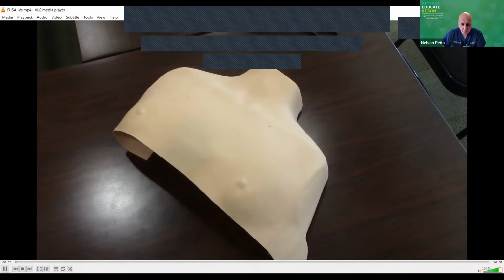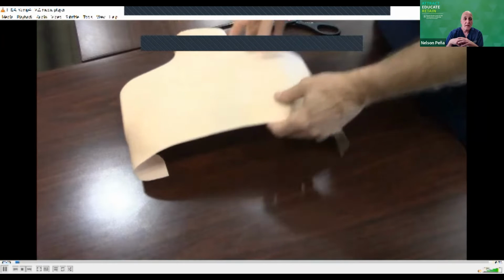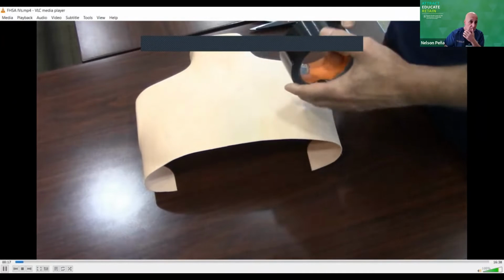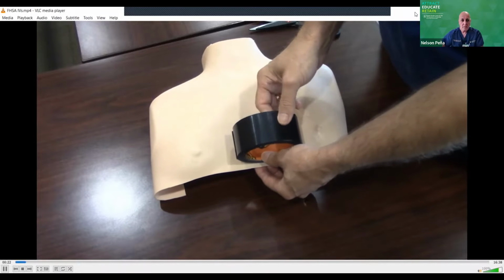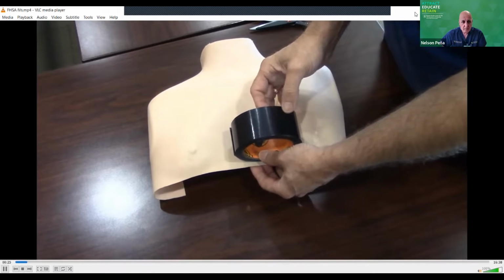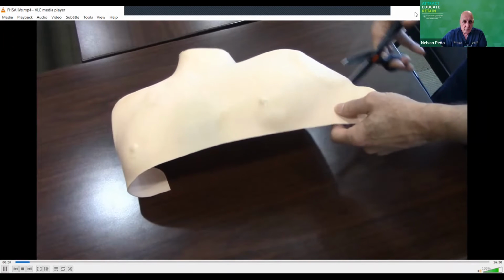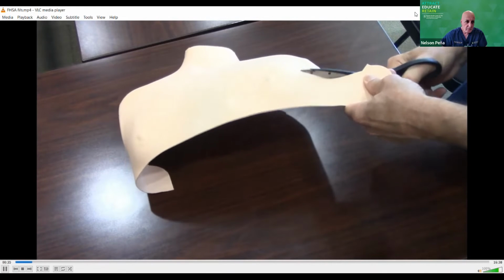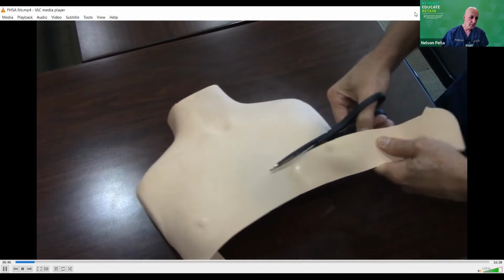Okay, so the first thing you want to do is get the strap that you're going to use for the external IV. Now, to build this, I use Gorilla Tape, and this is a 2-inch tape. It's a little under 2 inches. So you want to make sure when you cut yourself a strip, it's wider than the size of the Gorilla Tape. Now, here I'm using the skin from an old Annie. So I'm going to actually start above the nipples because I want a nice smooth piece of plastic. So I'm just going to cut across here.